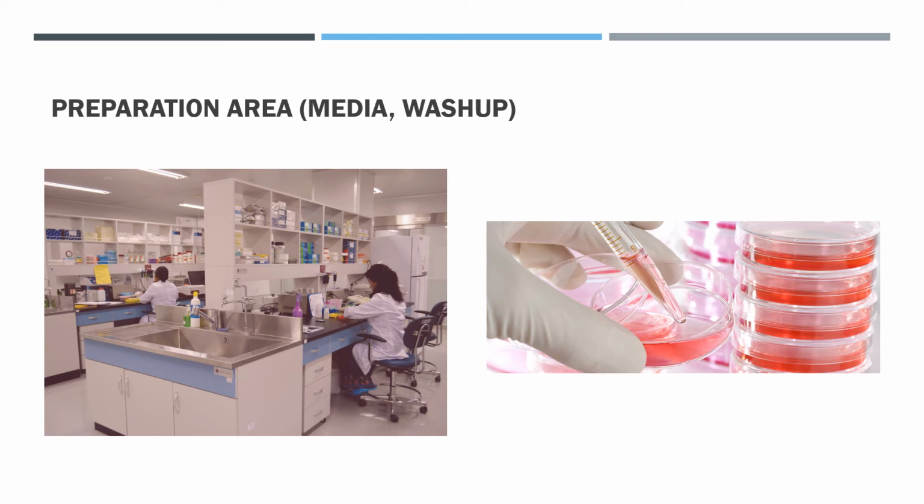Wash-up and sterilization facilities should be placed outside of the culture area to prevent humidity and heat buildup. Most preferably, autoclaves, ovens, and distillation units should be placed in a separate room. Ample bench space is also required for handling of baskets of glassware, sorting pipettes for sealing, and packaging for sterilization. Wash-up sinks of proper size should be fitted with 4 taps: for cold water, hot water, for deionized water, and one connected to a rinsing device.